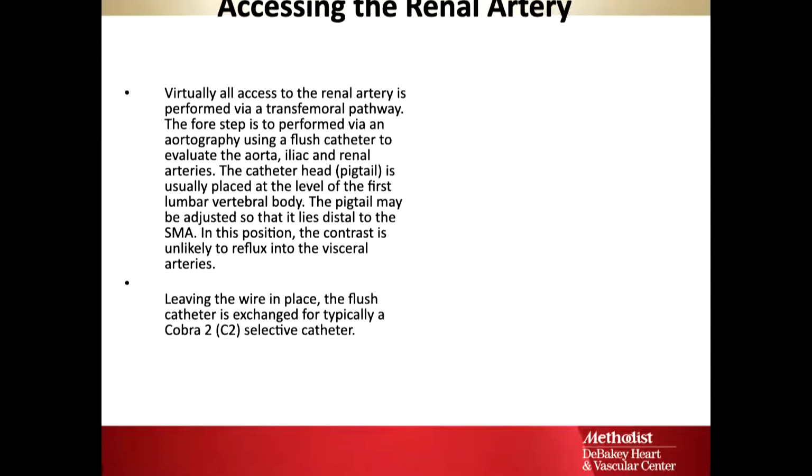People will have very precise feelings about how to do this. I've worked with people who would never reform a Simmons on the aortic valve. The idea is, if you're going to reform the catheter, reform it distal to the left subclavian, so you're not doing a lot of manipulation up in the arch. Because again, if there's plaque up in the arch and you're whipping around with the wire and you're not real savvy, you might as well take an egg beater and just start whipping it around. It's all going up the carotid.